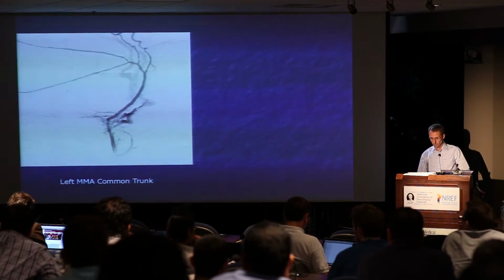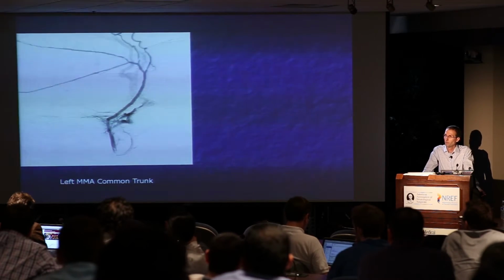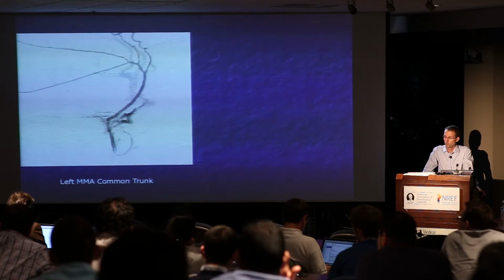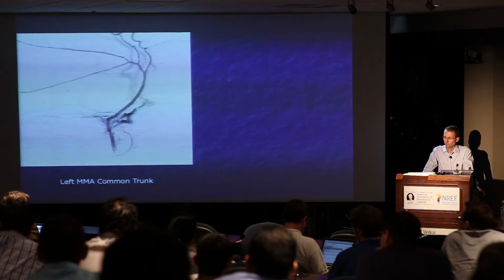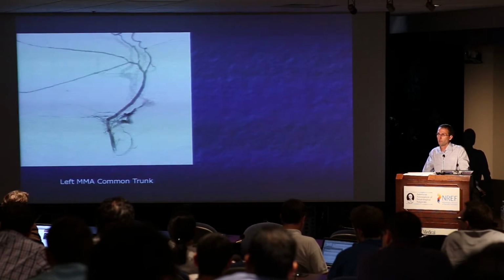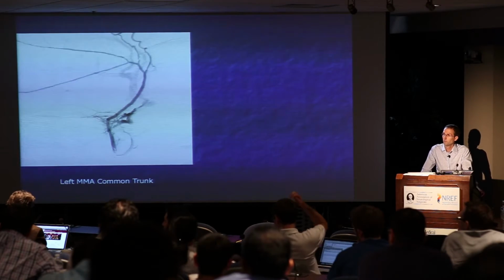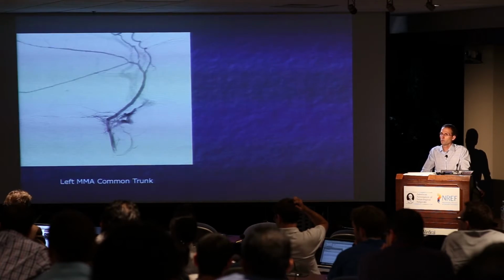That's okay. So there's an expression, measure twice, cut once, right, in carpentry. Well, we're not working on a 2x4. Yeah. And when I have seen myself fail or seen referrals of other failed treatments of AV fistulas, it is people neglecting to fully analyze all of the views and just starting to spray Onyx, often, or whatever, into the arterial side of a fistula.